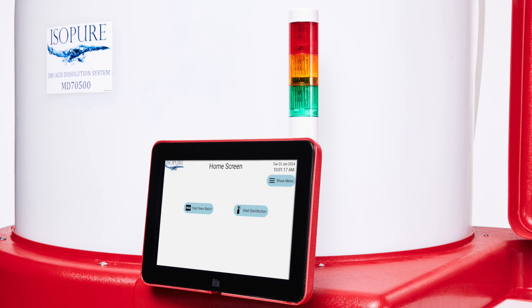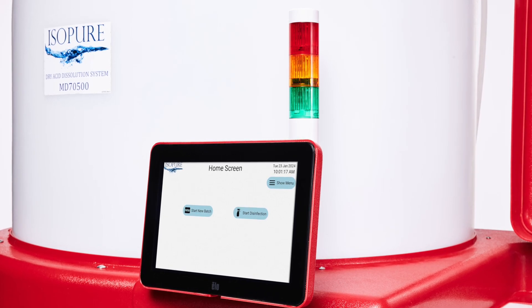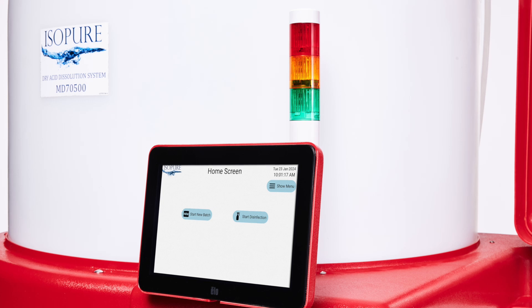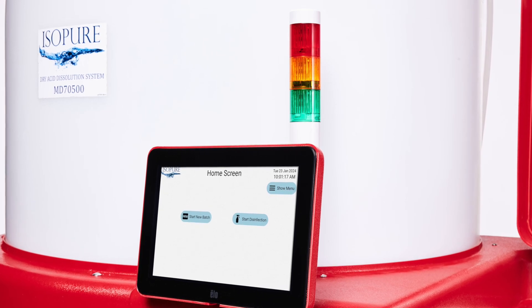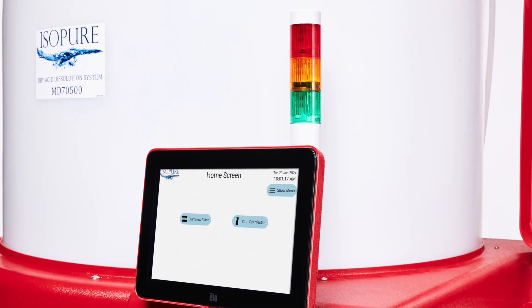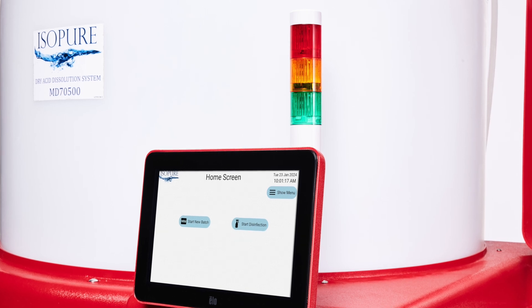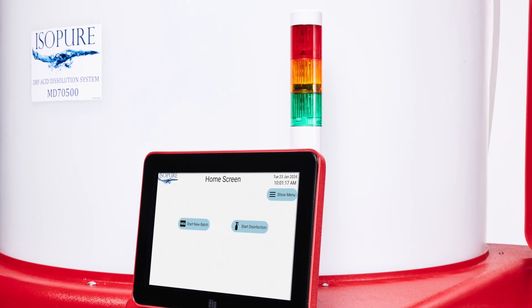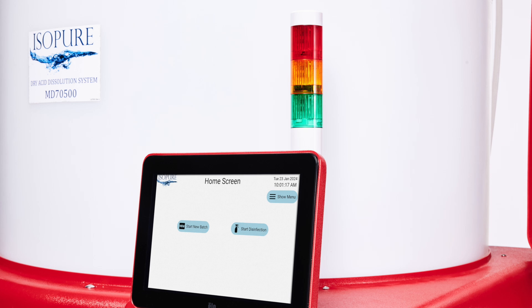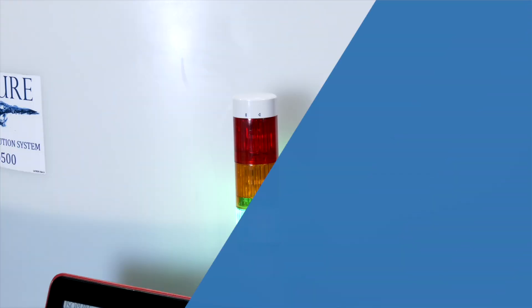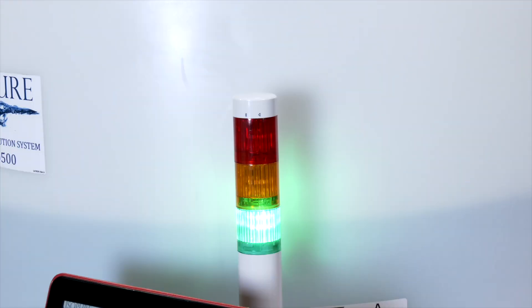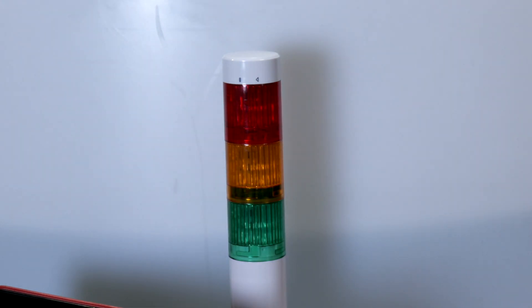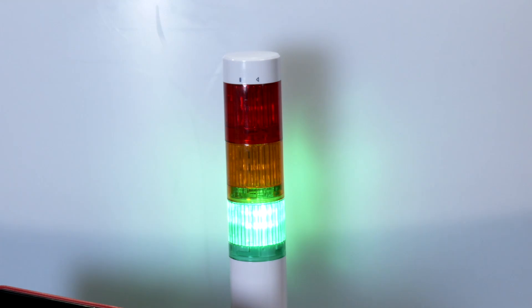The status indicator light is intended to provide the user with signals regarding the progress of automatic processes, the need for action, or any errors that may occur. A steady green light indicates that the system is plugged in and operational. At the end of mixing, the green light will flash when the batch has passed the specific gravity requirement and is ready to be transferred.